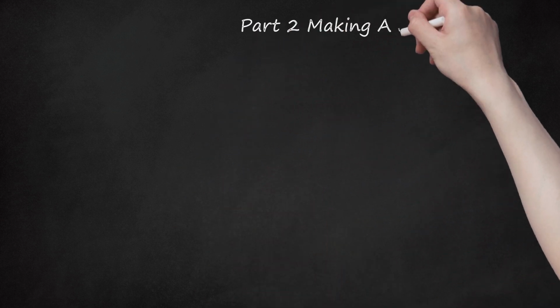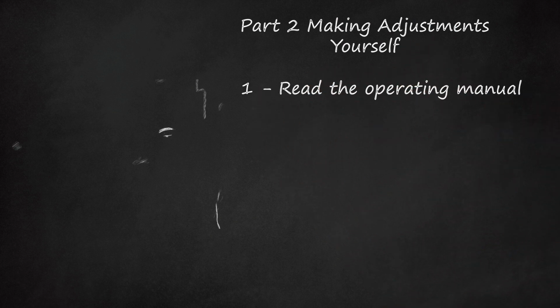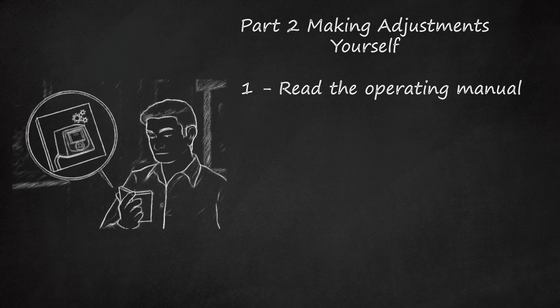Part 2. Making adjustments yourself. 1. Read the operating manual. Before you touch and manipulate the settings of your CPAP machine, make sure to read the operating manual and gain an understanding of your machine type and the available options.